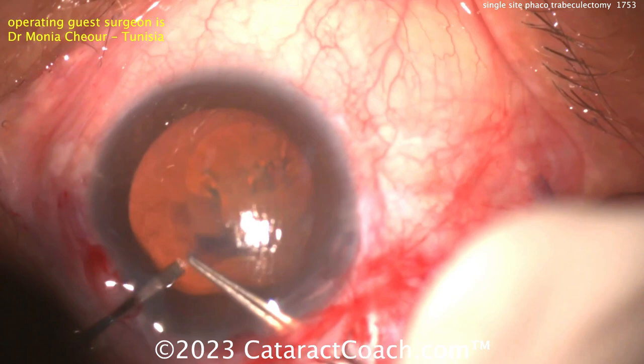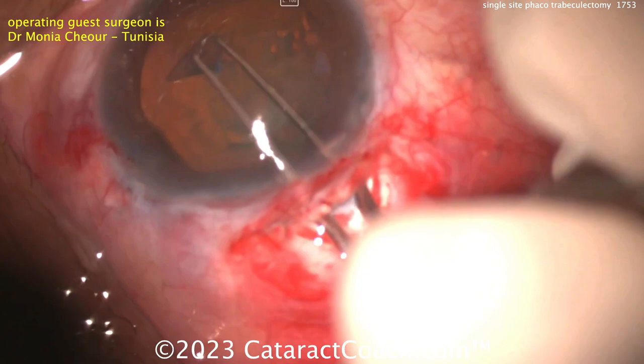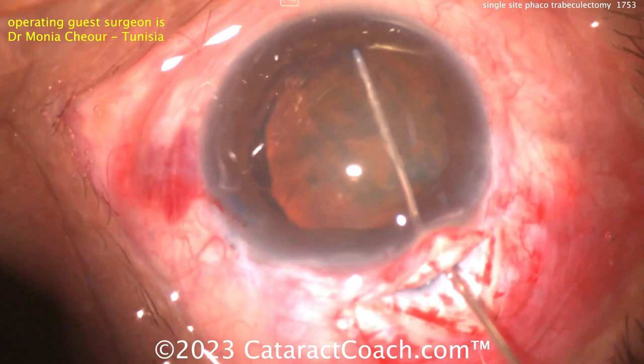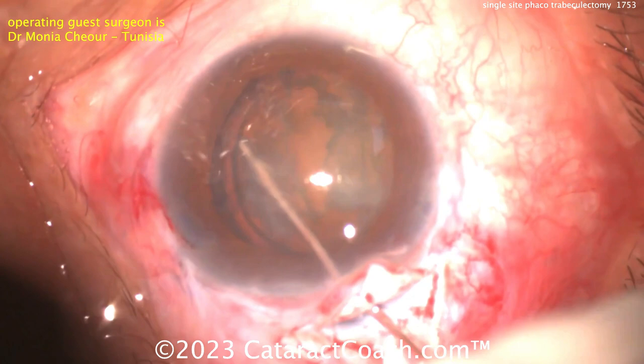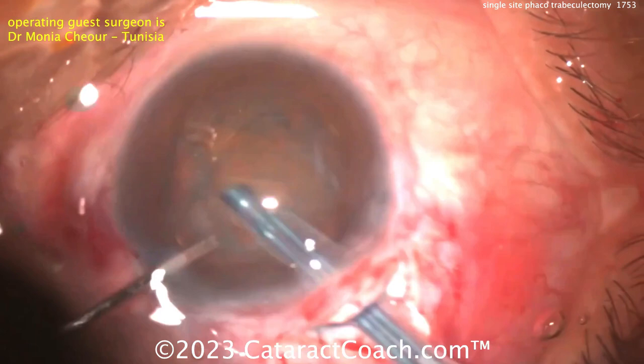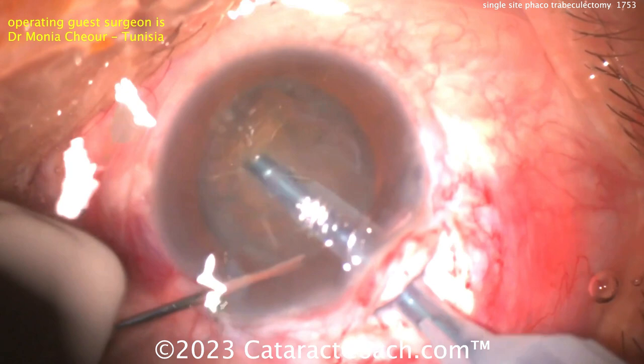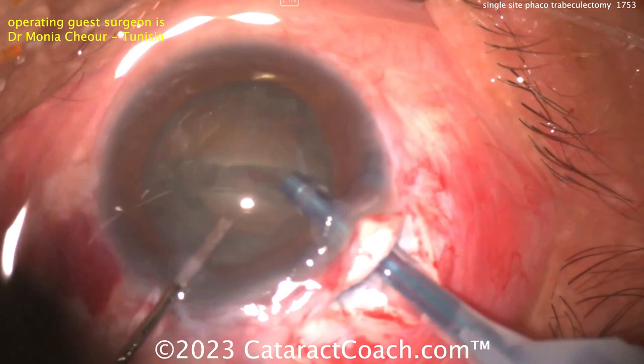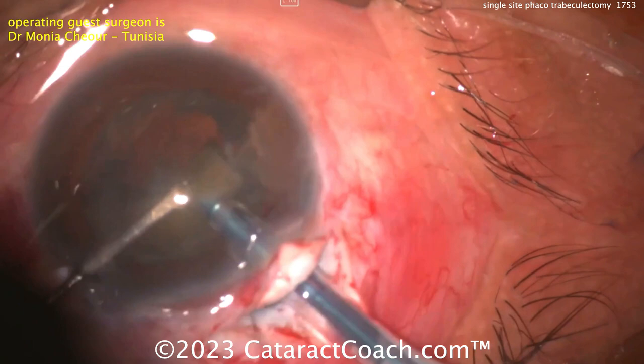The cataract part will be relatively routine here. When you do the capsulorhexis, make sure you don't do too big of one — in the trab patient you may have shallowing or flattening of the AC in the post-op period. This is a case where I'd do a slightly smaller capsulorhexis, maybe even 4.5 millimeters. That way, even if the AC totally flattens, you'll still keep the IOL fully in the capsule bag. If you have a 5.5 millimeter capsulorhexis and you get shallowing, the bag collapses and part of the optic can come out of the bag. So 4.5 is probably my sweet spot — at most 5.